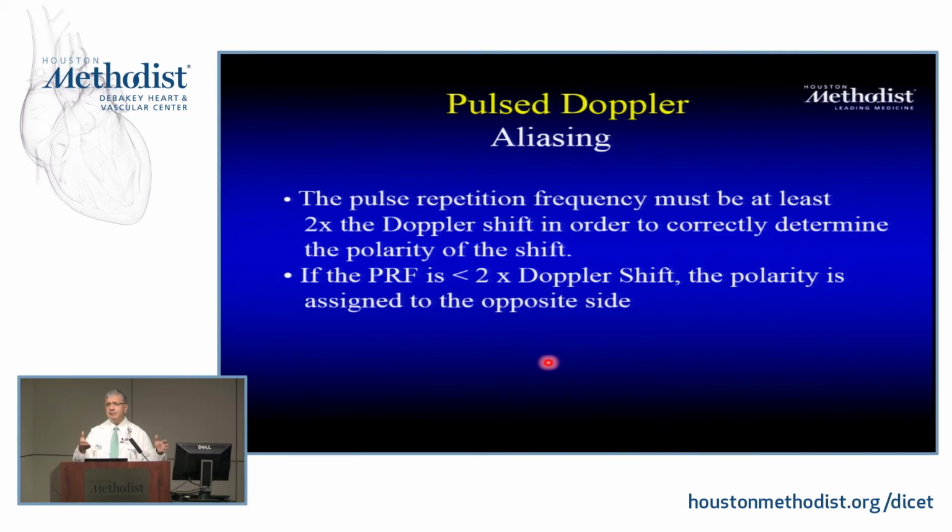And it's the same principle of stroboscopic imaging. If you go to a disco, whatever it is, and you're imaging only in stroboscopic, if you have a high frequency, I can tell the motion of an individual. If I have a low frequency and the individual is moving much faster, I cannot tell which direction they're going. I could be completely fooled. I could be almost in the reverse direction. Same thing with movie cameras and so many other things, right? So you need a certain frequency in relation to the velocity of these red cells or the muscle for you to be able to do that. Okay?